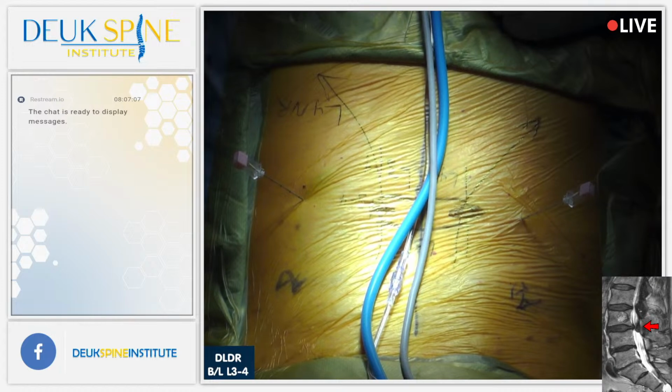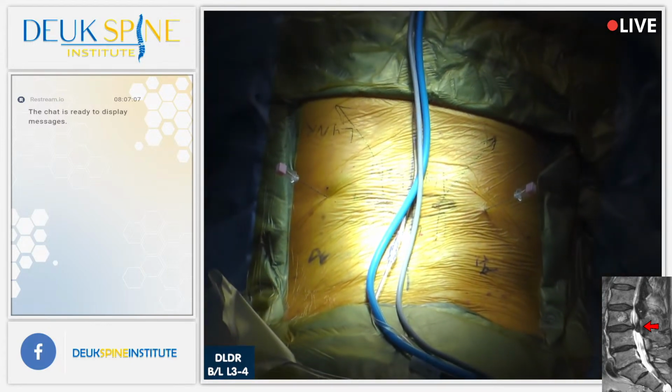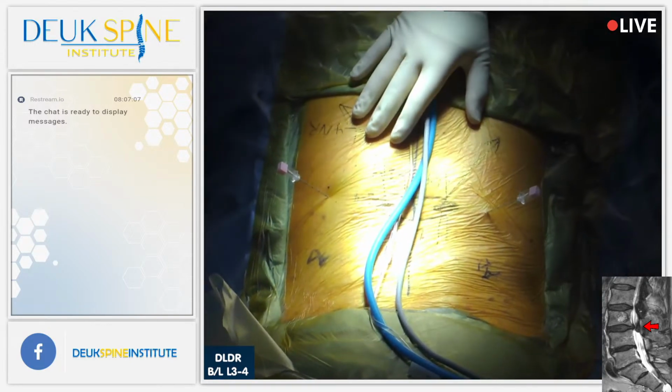So for this particular surgery in the lower back, our patients are awake just for the beginning to make sure we're not too close to that nerve root. And that's my only way to know for sure.